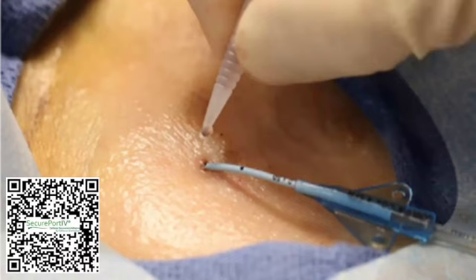Hi. We use Secure Port over here also. The things that I've noticed with the tunneled hemodialysis catheters, we've been having certain issues with controlling bleeding post insertion, requiring multiple dressing changes and then reaching back out to the IR team to assist with this. Is there anything besides the direct pressure? Unfortunately, with a heavy amount of oozing, the Secure Port does not seem to achieve hemostasis. So is there any other suggestion as far as with the dressing and the direct pressure that will help assist in reducing that post-insertion oozing?